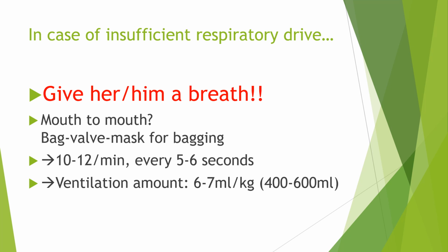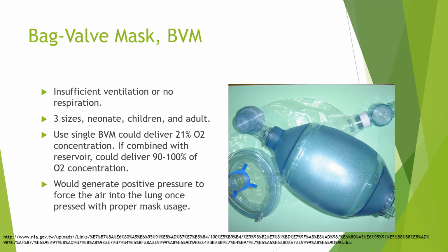The ventilation amount is about 6 to 7 milliliters per kilo, which means about 400 to 600 cc every time. So don't hyperventilate the patient and don't inflate too much, to avoid causing barotrauma. Okay, so now we are talking about the bag valve mask, BVM.